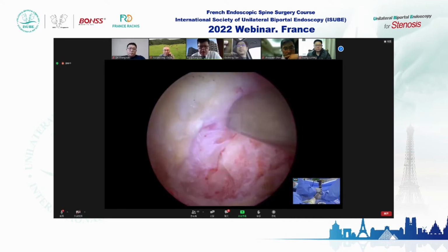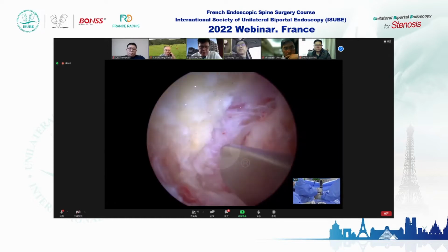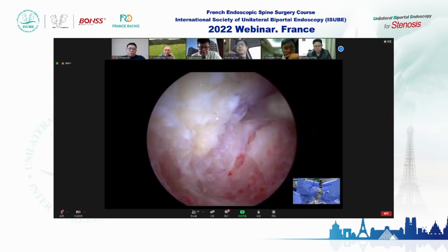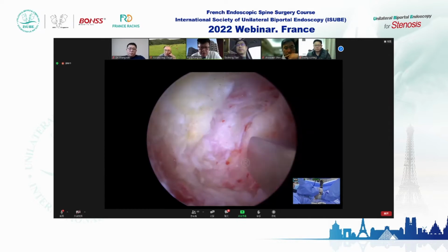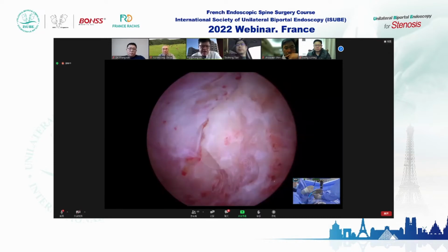Okay. This is the spinal canal and the thecal sac. This is the root here, the axillary area. Okay, this is the medial wall and the cranial wall. I removed some more of this area. Okay, covered. So the first point of identification by Dr.